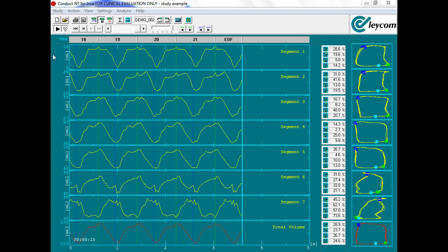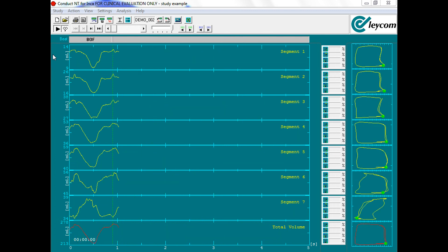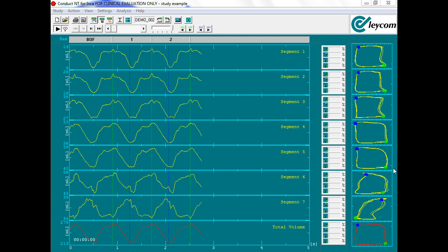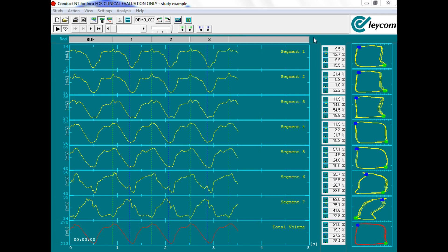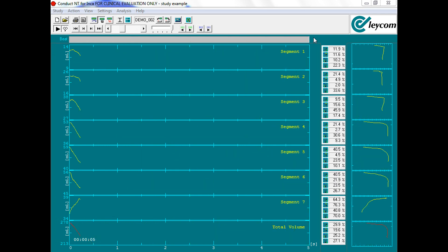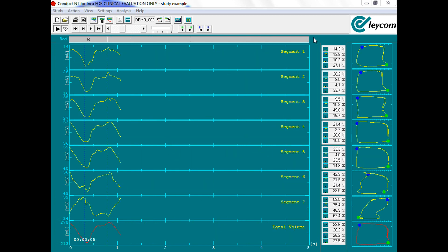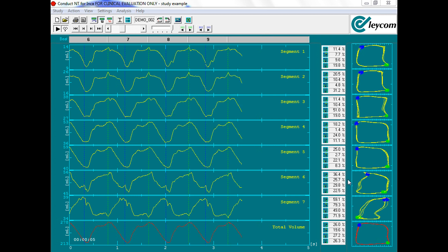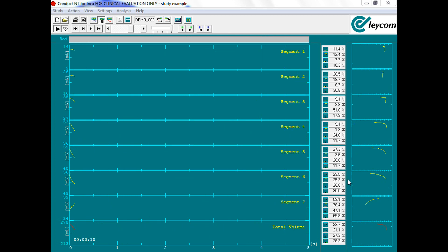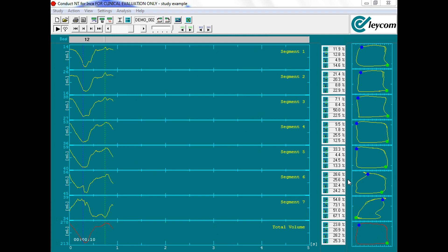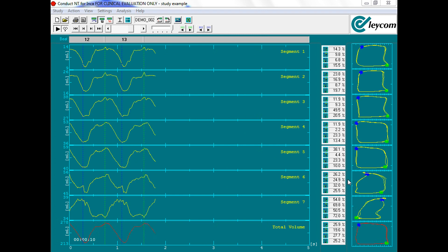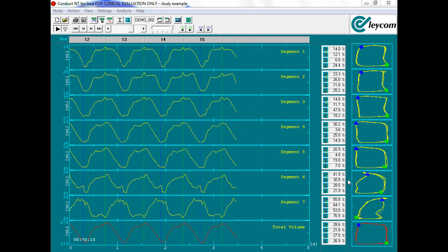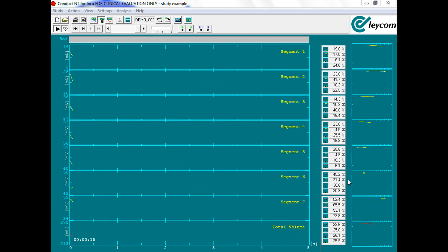Next, we will determine centeredness of the PV catheter by looking at the segmental PV loops themselves. One should expect to see counterclockwise PV loops as well as a fairly rectangular shape to indicate quality positioning. For RV PV loops, the loops may be more triangular in shape but they should be in a counterclockwise orientation.